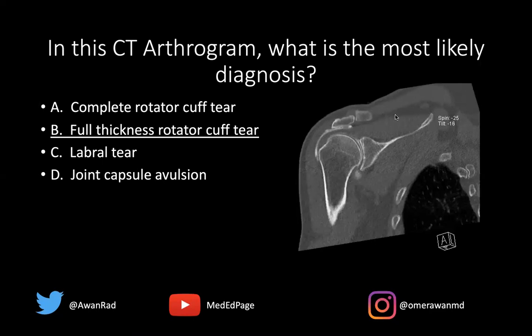The only way that contrast can go from the glenohumeral joint all the way into the subacromial subdeltoid bursa is that it has to traverse the thickness of the rotator cuff. This is the supraspinatus muscle, and this is the tendon. The only way to get from here to here is to breach the entire thickness of the tendon, thus making this a full thickness rotator cuff tear.